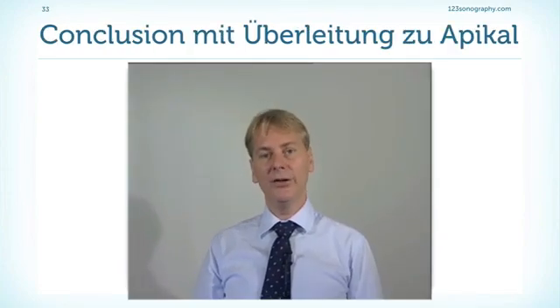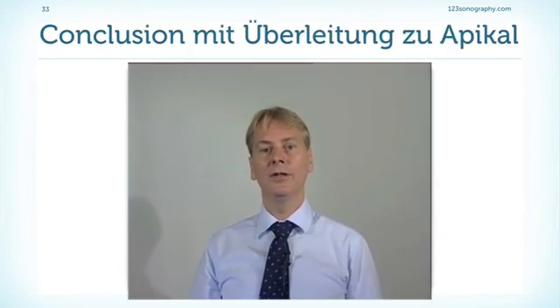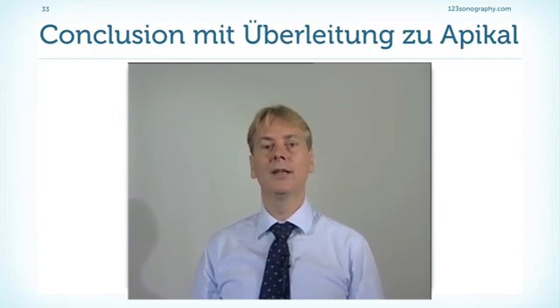So this was the parasternal window, but now let's take a look at another window which is very important, and a window which should be performed right after we perform the parasternal window, the apical window.